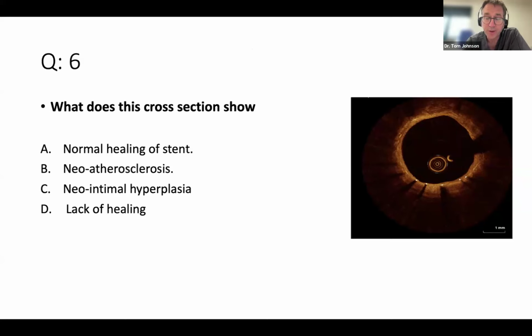A really important thing there is to understand what the software is doing, because sometimes the software can mislead us. There's a lot of talk about artificial intelligence and how that's going to dominate helping us in terms of our decision making, but it's not perfect by any means. So it's really important to understand both looking at an image and how the software has interpreted it. In this setting, it has rightly identified 5 struts. We see white dots across 5 struts, but it's then missed struts beyond.